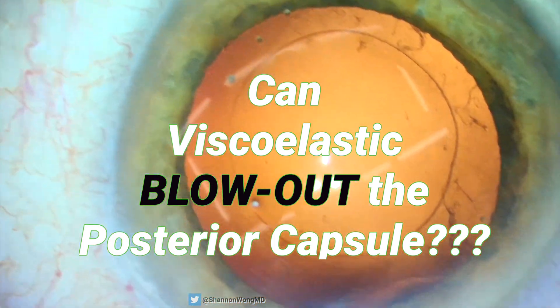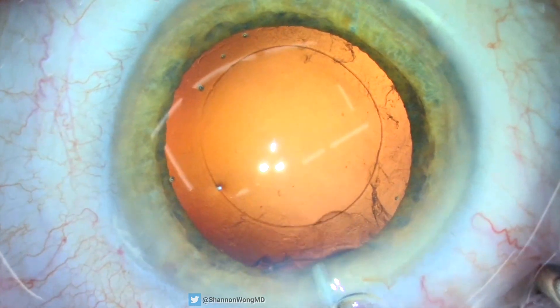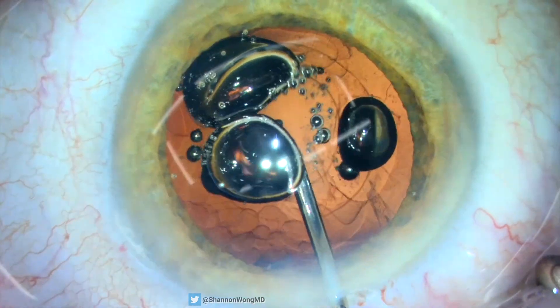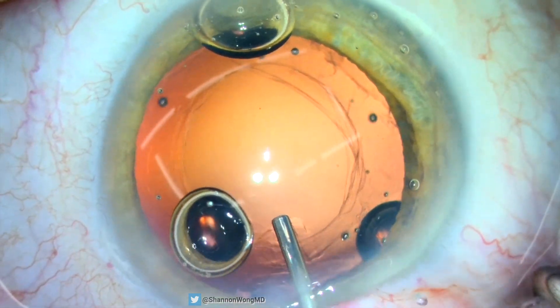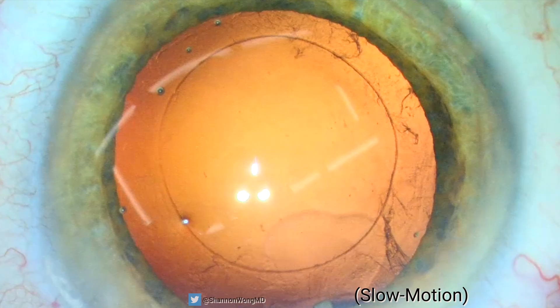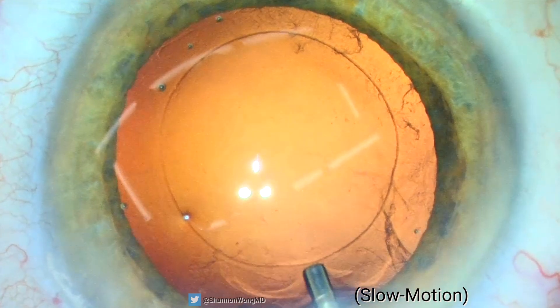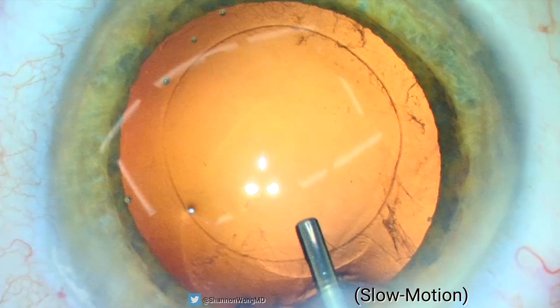Can viscoelastic actually blow out the posterior capsule? Here we are: we safely remove the cataract, polish the bag, and are about to place the lens implant into the eye. We gently place viscoelastic in the eye — but wait, what just happened? Let's take another look at that in slow motion.